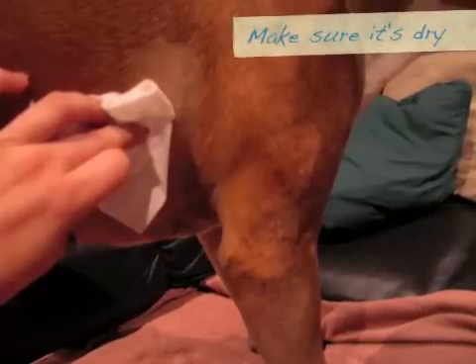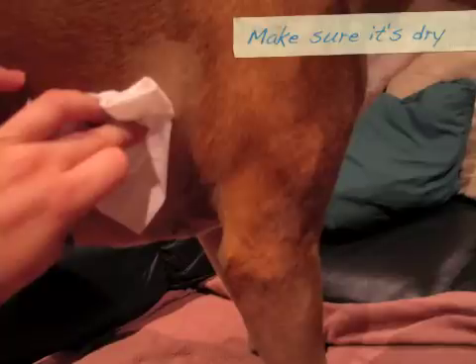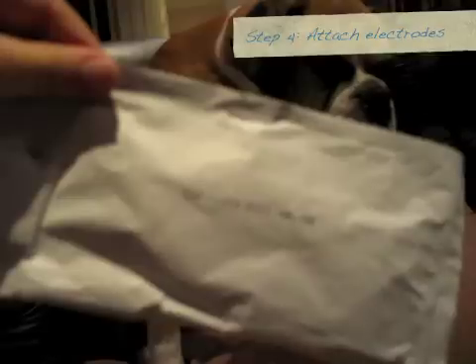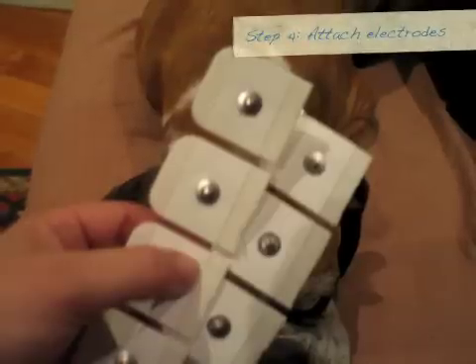Very important though to make sure you dry it completely afterwards before you start attaching electrodes. For the particular machine that I use, this is what the packet with the electrodes looks like. And again, because my machine has 7 leads, I've got 7 electrodes.